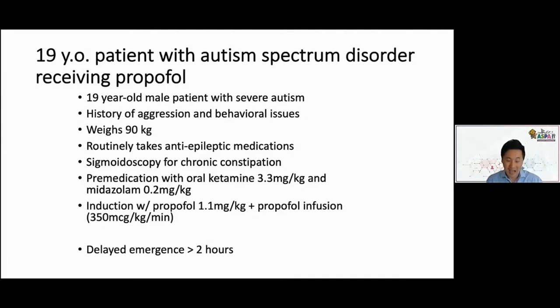So what happened was there was a delayed emergence for 2 hours, for an endoscopy procedure, right? And the people in the endoscopy suite actually called us up and were like, "Hey guys, can you come back and put that EEG strip back on and tell us what's going on?" Well, we didn't do that, but we analyzed the data, and here's what happened.